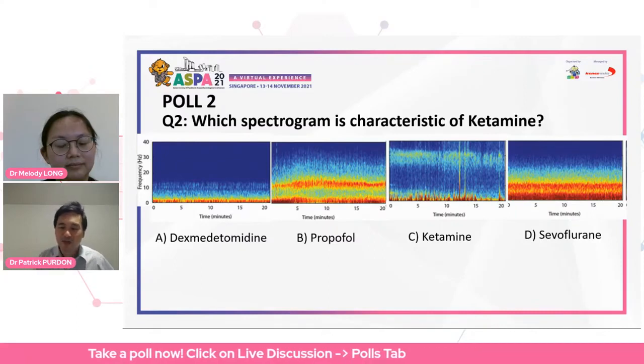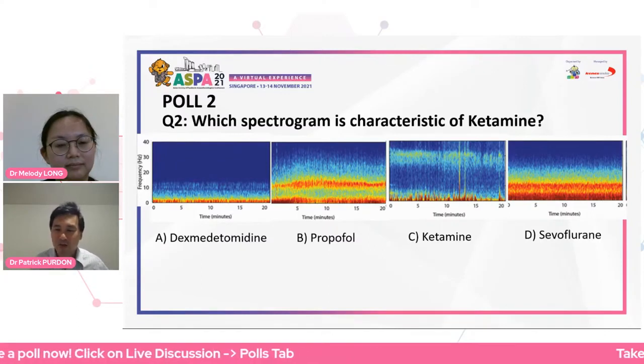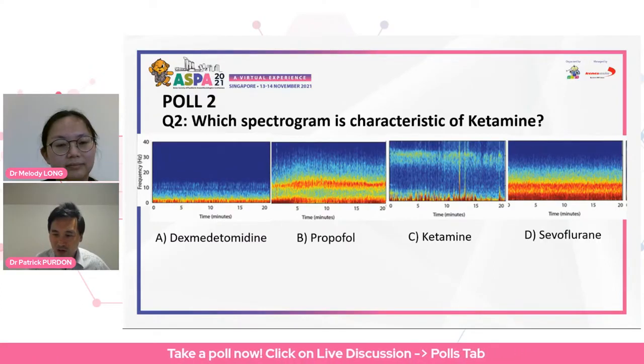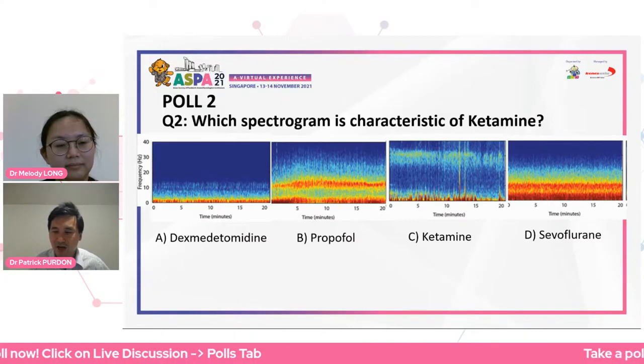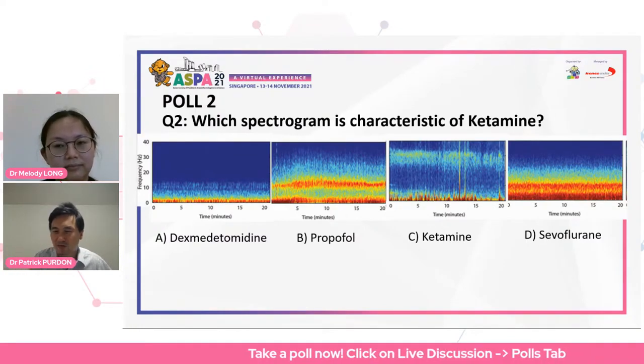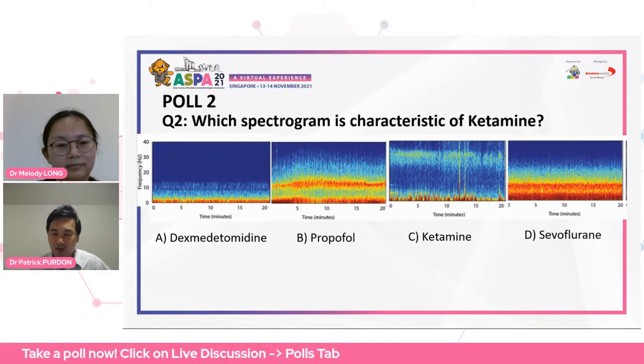I think the thing that distinguishes the two drugs is that with sevoflurane, as you increase the end-tidal anesthetic, that alpha wave will get closer and closer and sort of fill in the gap between the slow oscillation and alpha. So you can see the waves are a lot closer together, and all that space in between is almost filled in with red. And so that's really the difference with, say, sevoflurane versus propofol.